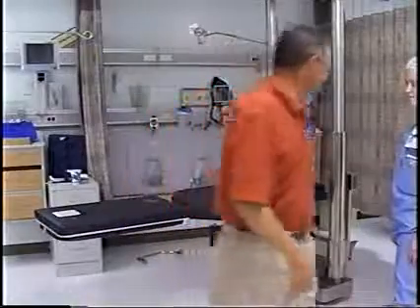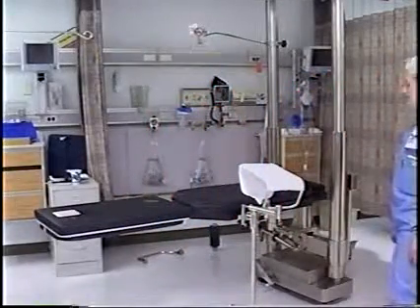You're doing fine, Amy. What else? Perineal post.